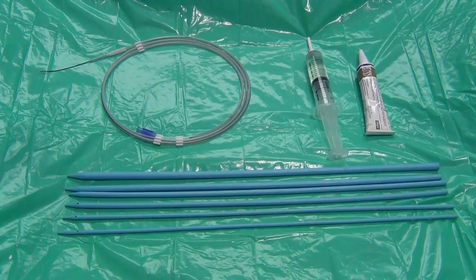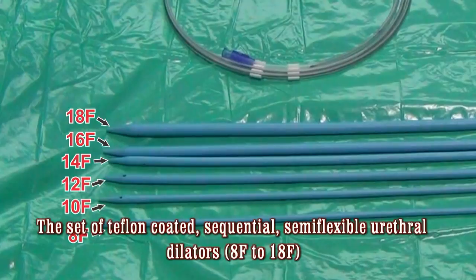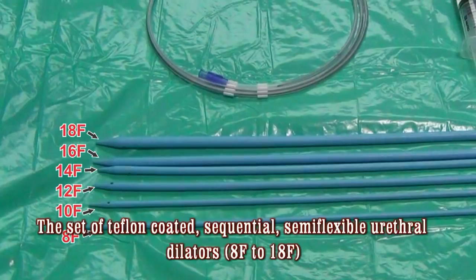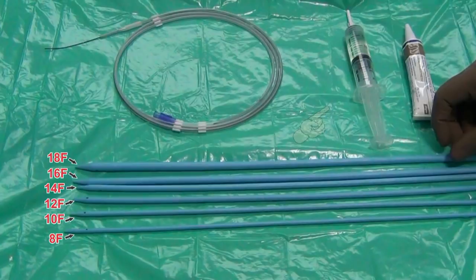The gadgets you may need for this procedure are a set of Teflon-coated semi-flexible urethral dilators, which come in various sizes from 8 French to 18 French. You also need a hydrogel-coated floppy-tip guide wire, topical lignocaine liquid — I use sometimes four percent — and a tube of lignocaine gel two percent.